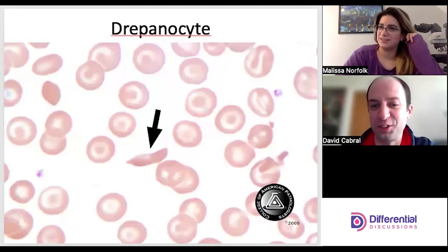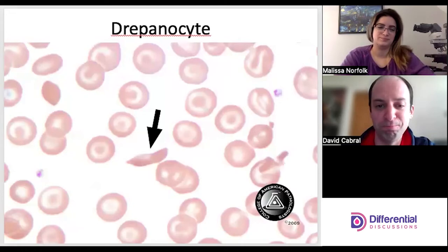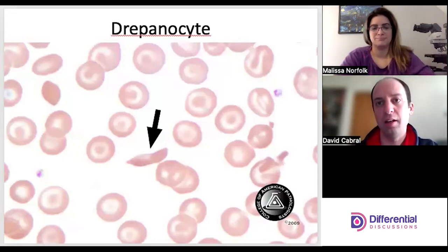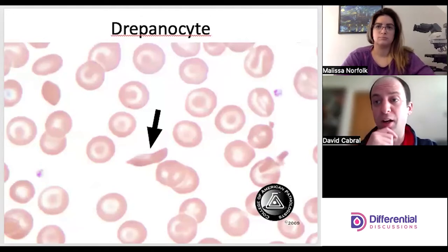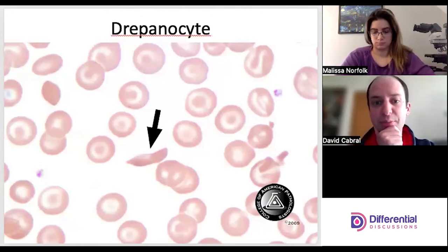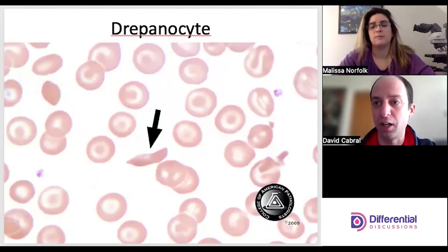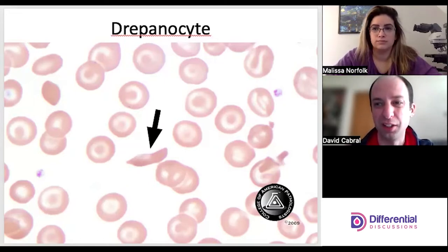Drepanocytes — our beloved sickle cells. They can range from a bit elliptic to full-on sickle shapes. Most of the time they'll have a deep red coloration due to the dehydrating nature of the physiology going on in the cell, which really concentrates the hemoglobin.